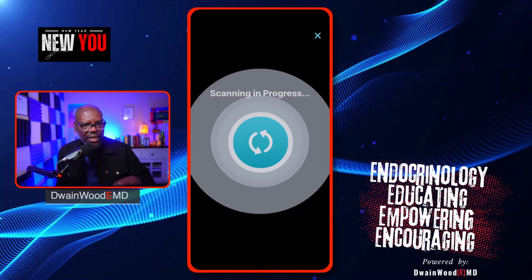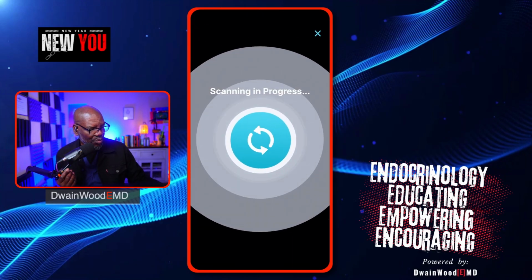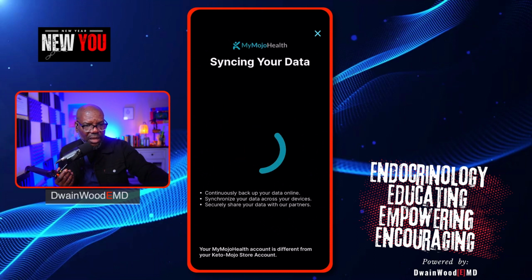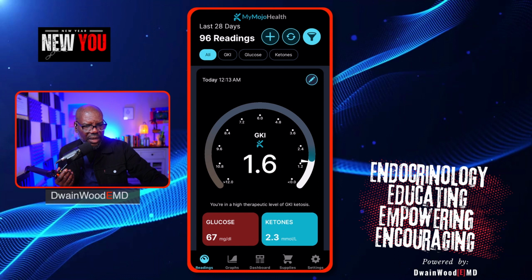So what do you think our ketones are going to be? And let's go ahead and get that to sync. So it should start pulling that data right across. Here we go. Yep, there we are. All right. And so there it is. So my blood sugar was 67 and the ketones are 2.3. Talking about ketones, right?